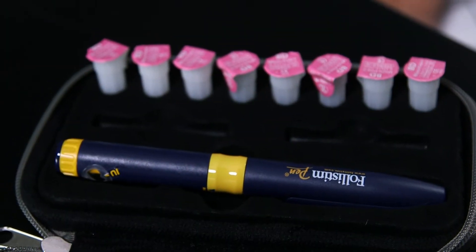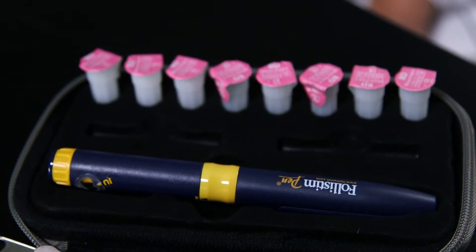The Follistim AQ cartridges come refrigerated from the pharmacy. Please put them in the refrigerator when you get home. They are able to be kept at room temperature for up to 90 days if they're unused, and once you've started using it, they're good for 28 days at room temperature.